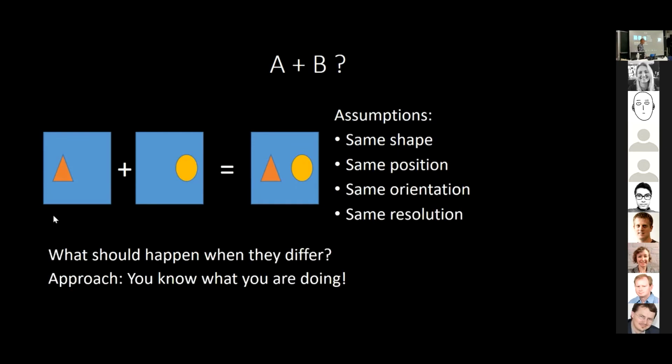You can do the same thing as well. Since this is built on top of NumPy, you can add an integer and a floating point image, and you will get a floating point image. You could save that to NIfTI, you could save that to DICOM, and that would work.